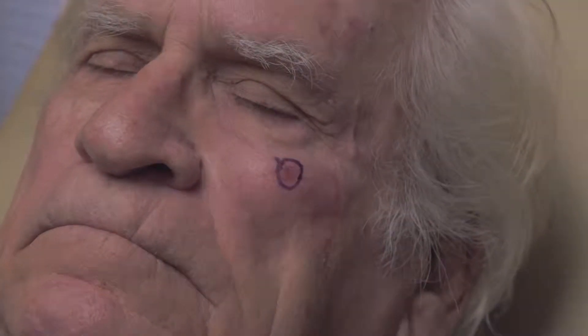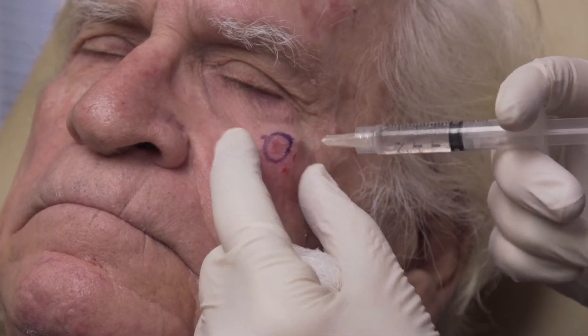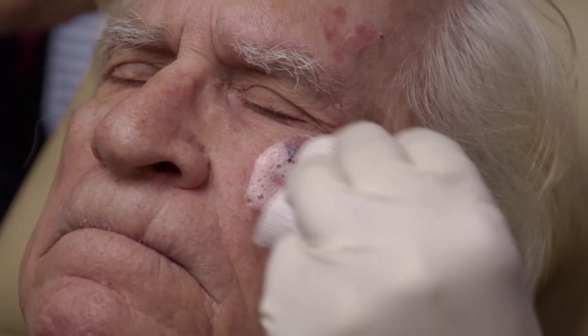The area will be cleaned with alcohol, sometimes marked with a marking pen, and then injected with a local anesthetic. The local anesthetic does involve the use of very fine needles, and hurts very briefly and fairly minimally. After that, the area should be entirely numb for about two hours.